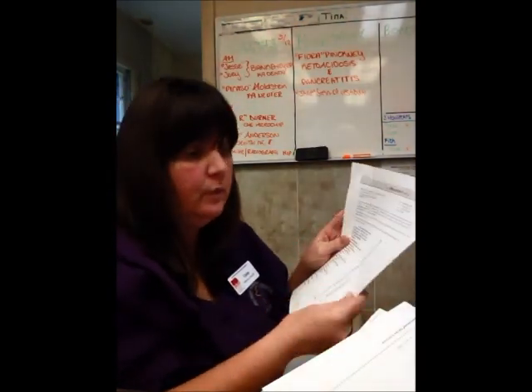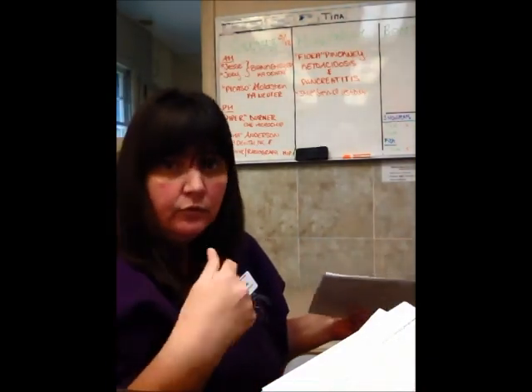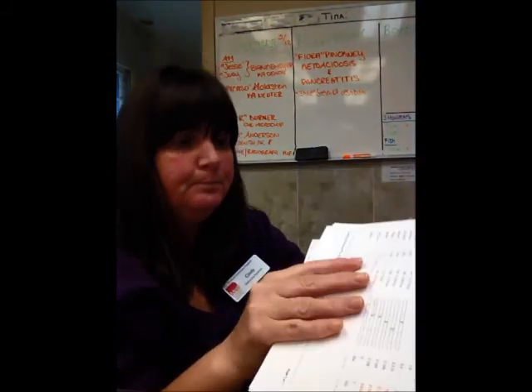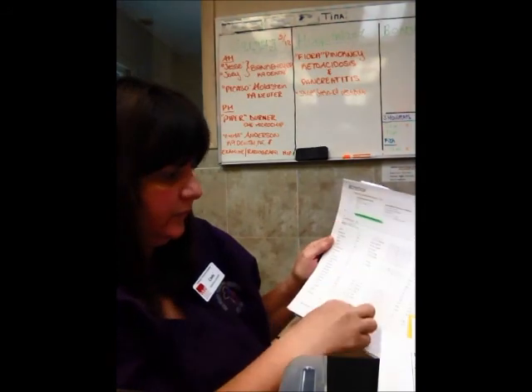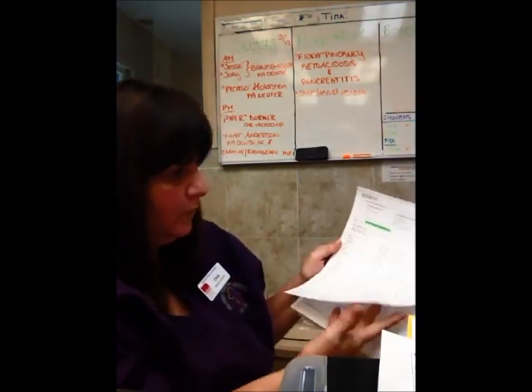So they will get a copy of that, they will sign a copy, and that will get scanned into the records just like the previous records get scanned in. Then if any additional blood work or additional work is needed, actually any of the forms that might be needed. So this is our IDEXX, we sent them out for blood work, so this is blood work results on one of our house cats.